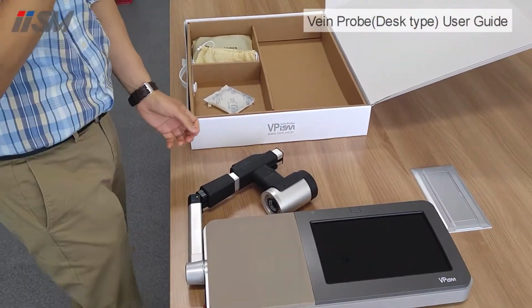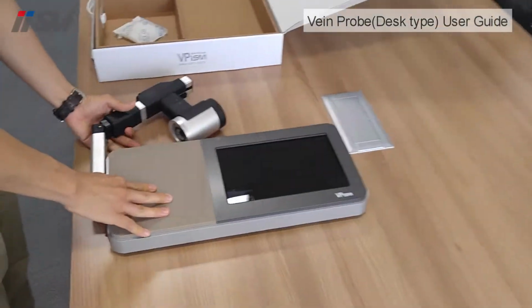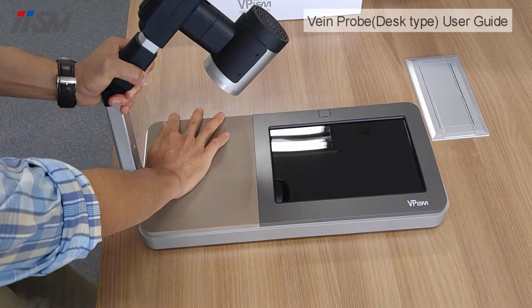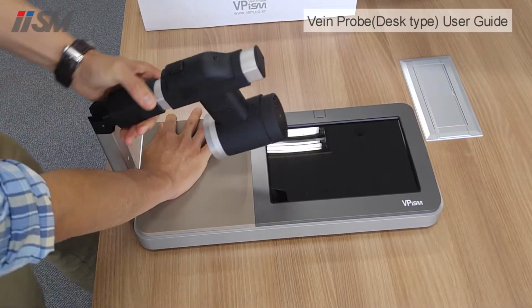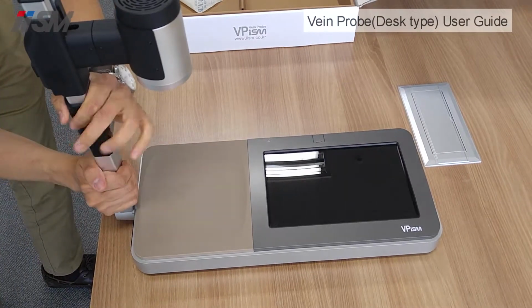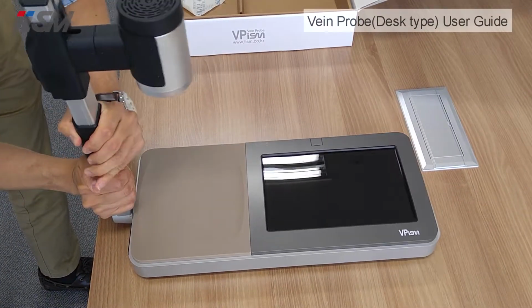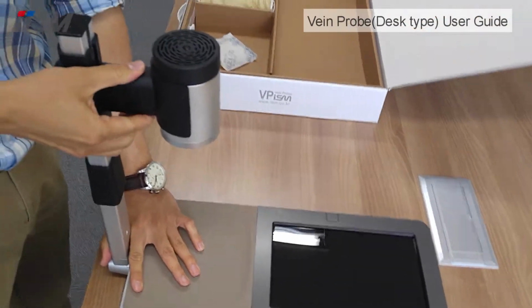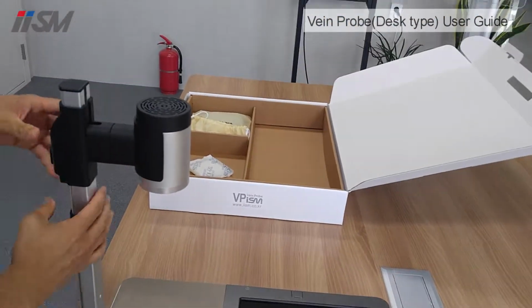Okay, you see it like that, and then you turn the stand 90 degrees. Careful to hold the camera and the LED, and then you move down this mount. Okay, there, that makes it firm and stable.